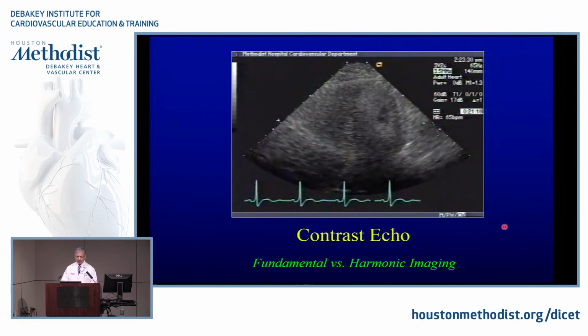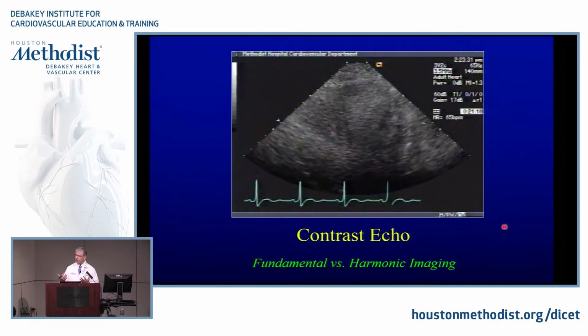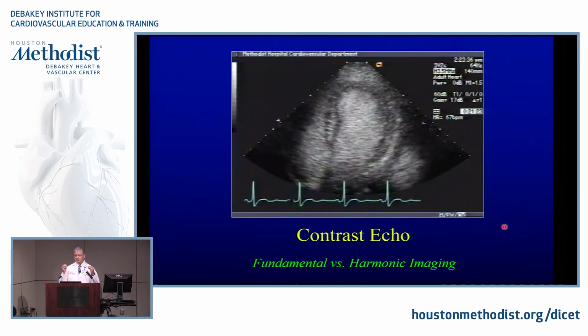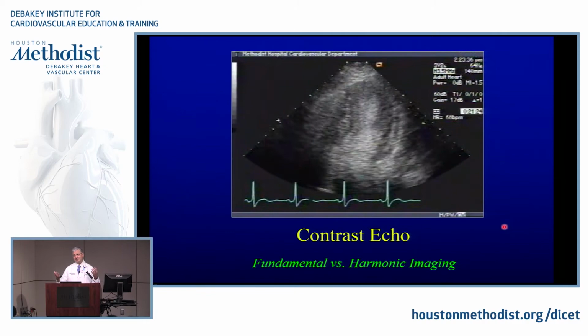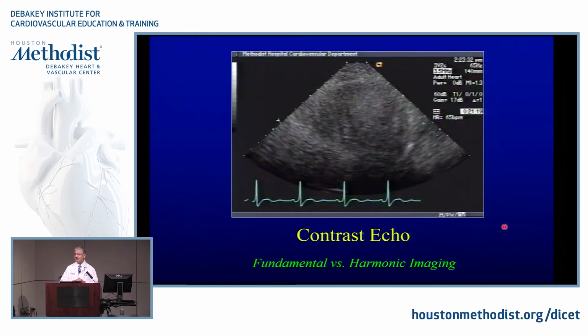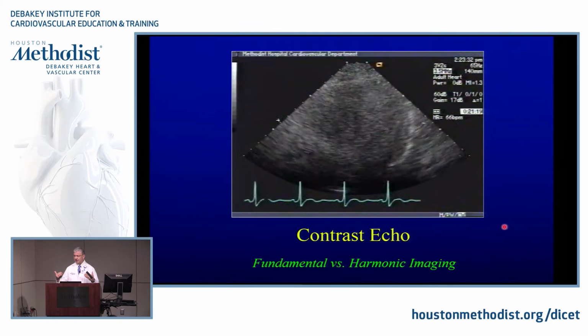Indeed. A very important question from Jeff is, everything is sending back something, right? And why, if I put on harmonic, do I see much more contrast than myocardium? That's the beauty of it, actually. Believe it or not, harmonic imaging came on board because of contrast. Nowadays most sonographers use harmonic to see myocardium, because initially we thought myocardium would not emit any second harmonics. Actually, myocardium does emit second harmonics, as you may remember from the first lecture, with some caveats and good things. It takes away reverberations and clutter, particularly close to the apex, and that's why you see it.